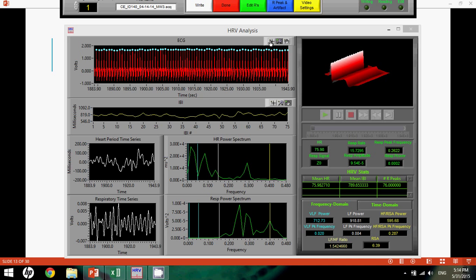For the time being, you simply need to know this and this. These two modules are going to be important for you. Furthermore, you're going to take a look at this heart rate information here frequently. You'll also see that the mean heart rate is down here. You'll see that mean IBI is down here, and you have the number of valid R spikes within this segment. Typically, that's the only information that you'll need to know, except for the RSA down here.